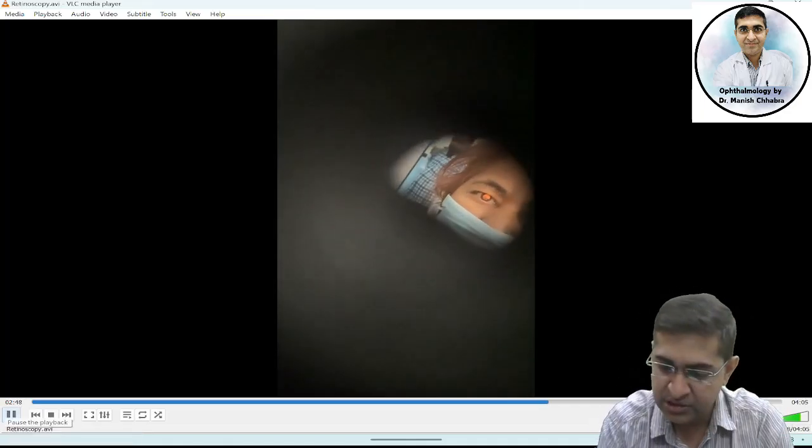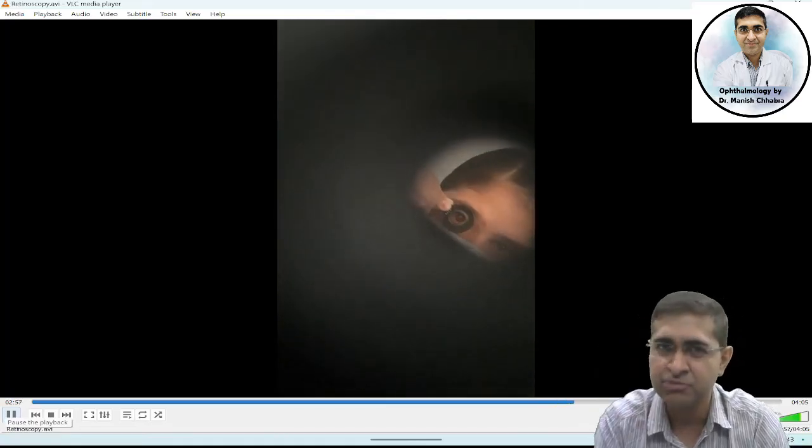It is always better to do retinoscopy by dilating the pupil because the chances of error are minimal. Sometimes even if you are doing dry retinoscopy in which you are not using any cycloplegic, the patient still looks towards the retinoscope and it can lead to errors. Yes, so first x-axis and then y-axis both are with the movement of the reflex. Plus glass, black glass generally is plus glass, red glass is generally the minus glass. So still it is moving.